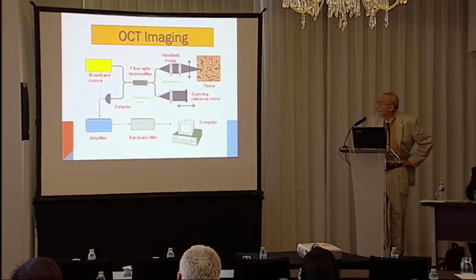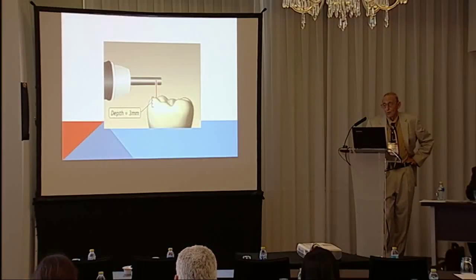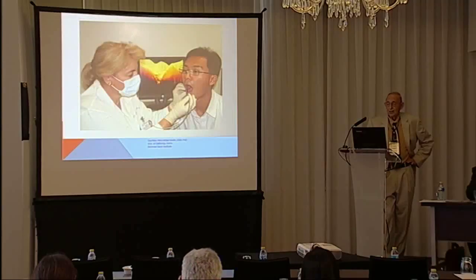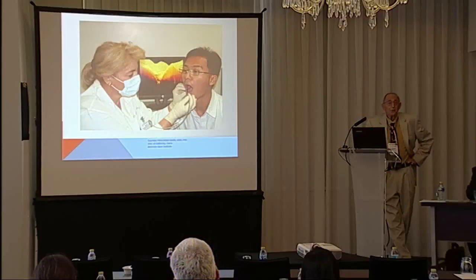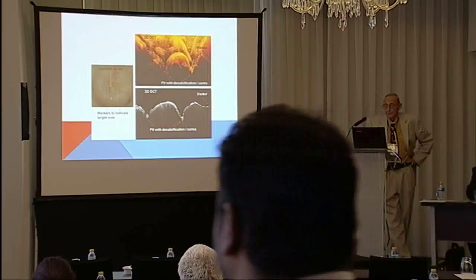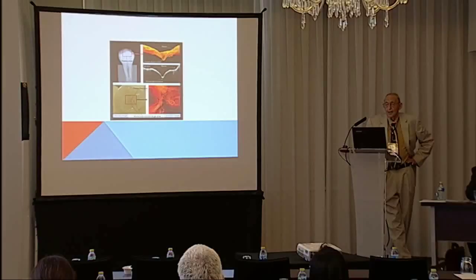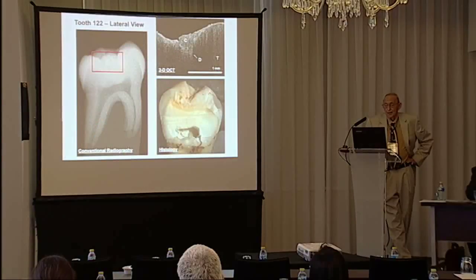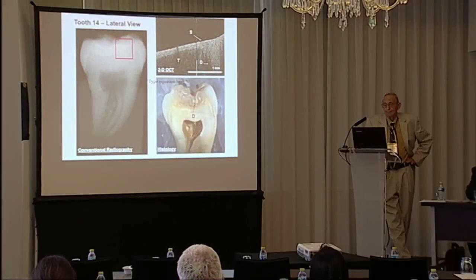Here's the setup for the OCT, which I showed you before. Our probe, machine. This is based on work by Petra Wilder-Smith at University of California, Irvine. This is what the markers show. Again, lateral view with histology.